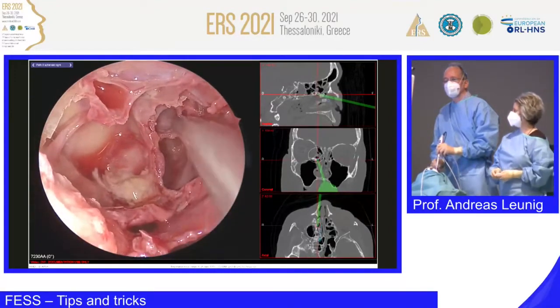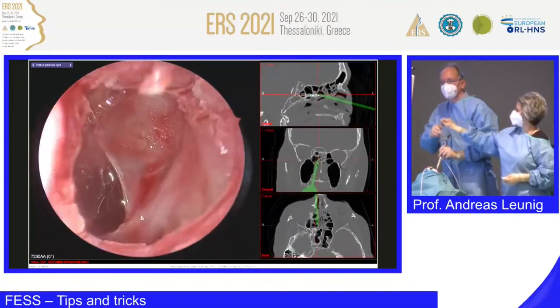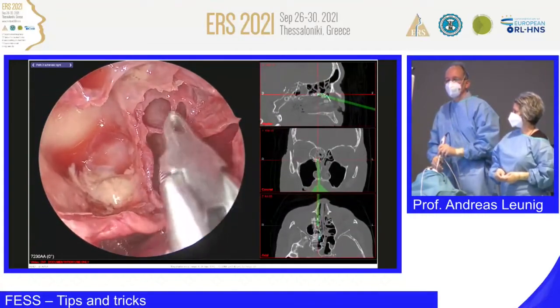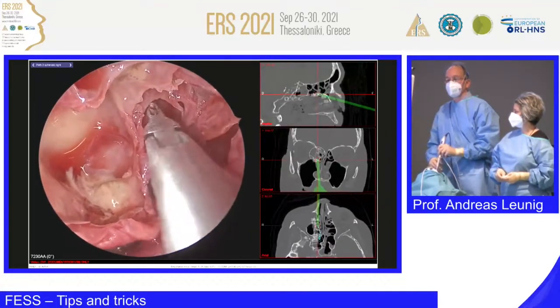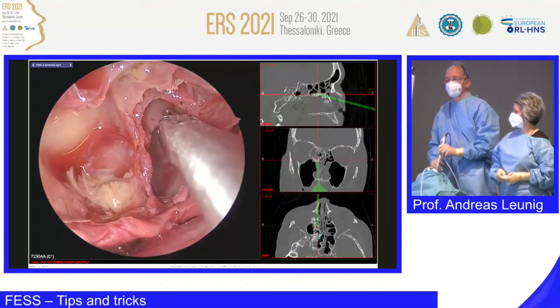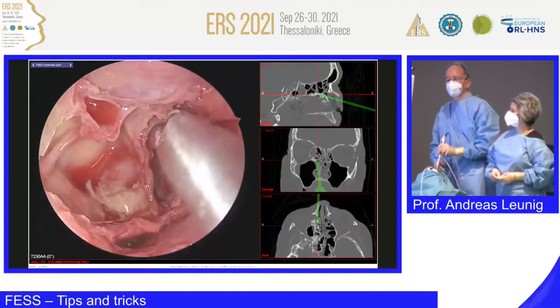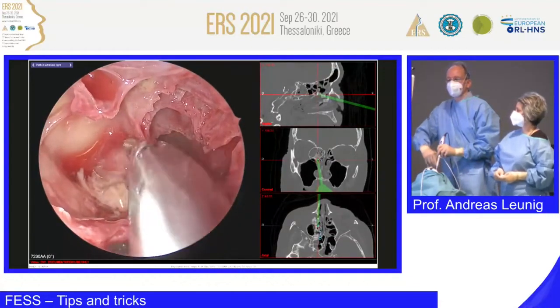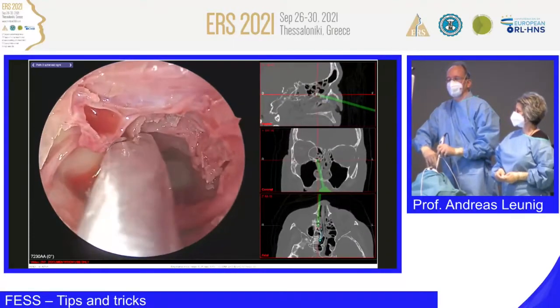You should be very careful with the through-cutting instrument, the Blakesley, because in the posterior ethmoid you may have exposure of what structures? The optic nerve, yes, and the internal carotid artery. We have seen nice cases, only single cases, where you could damage these structures in case you are not aware and not familiar with the anatomy.